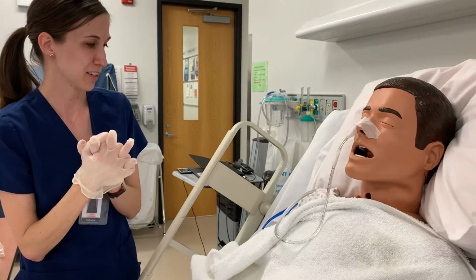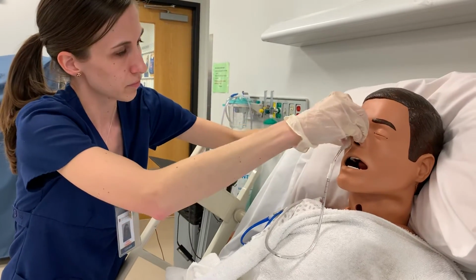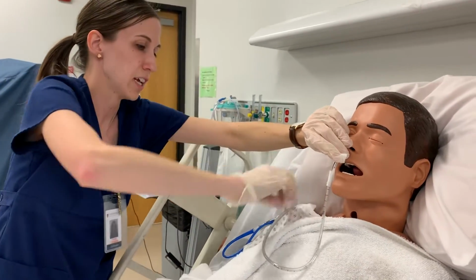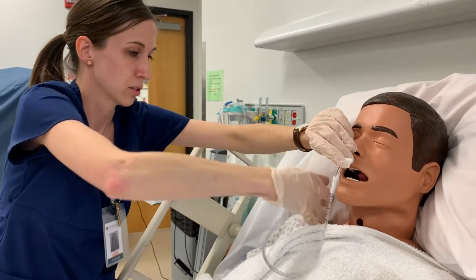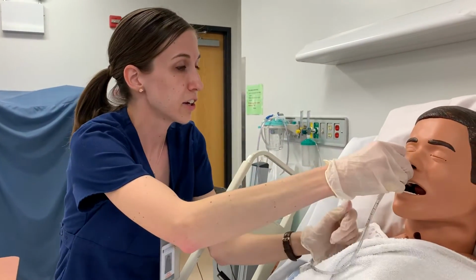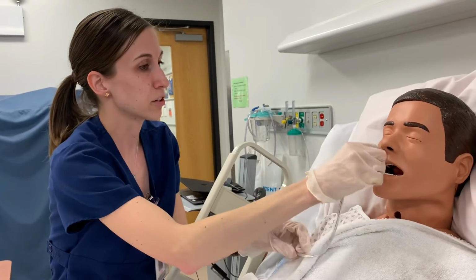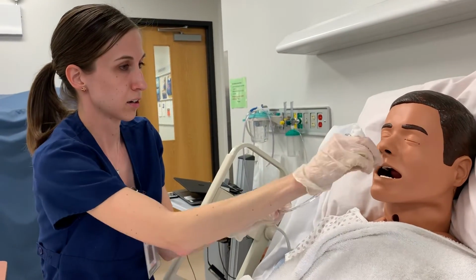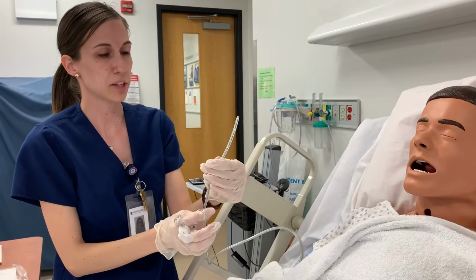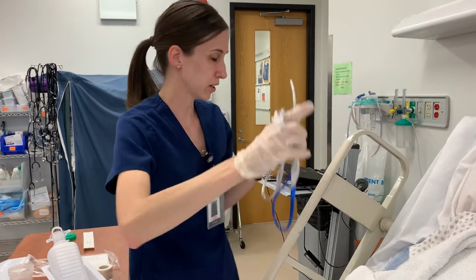So again, I had new gloves, did my hand hygiene, so I'm going to be removing the tape from your nose. Oops, this paper tape really stays pretty good. I'm gonna remove the tape or the securing device from the gown. This is very sticky. Okay, and so then now I'm gonna ask my client, please hold your breath, and while they hold their breath, I'm going to remove the NG tube gently and steadily while controlling and maintaining the tip of the catheter. Okay. Oops, very long. And so I'm going to inspect that tip of the catheter for integrity. Looks like it is still intact, so I can discard of all of my tube in the appropriate receptacle.